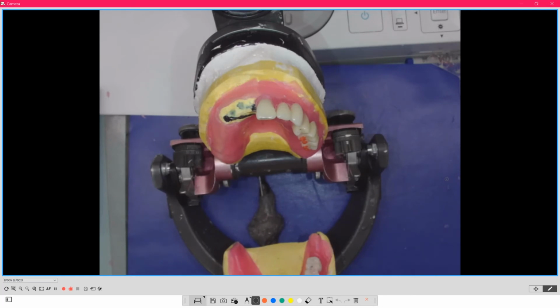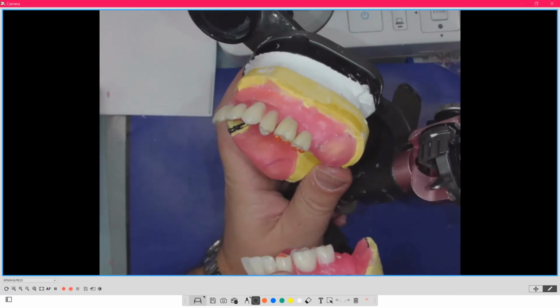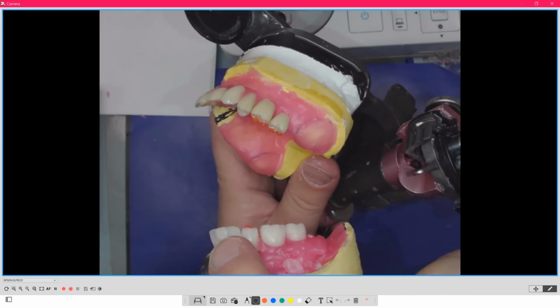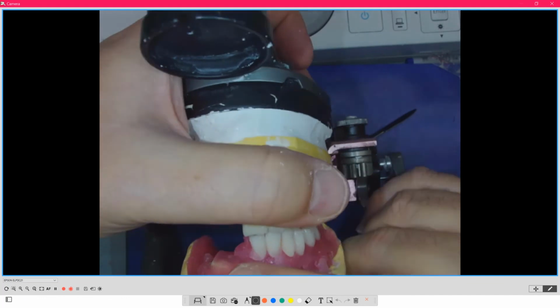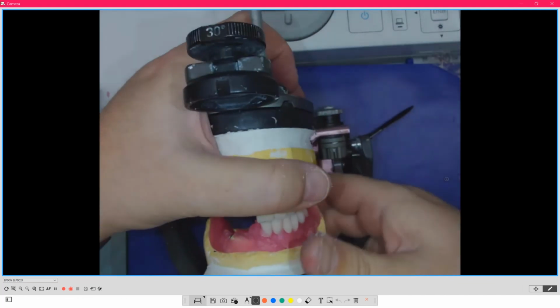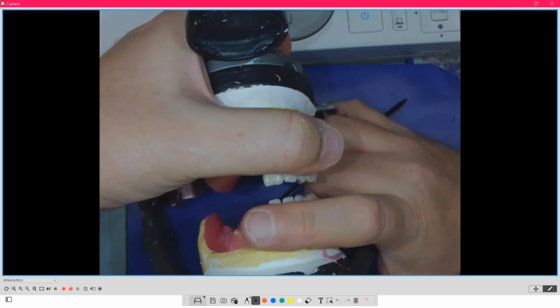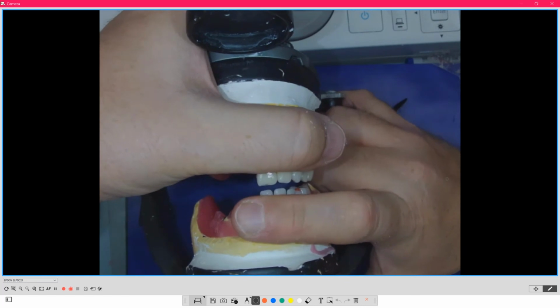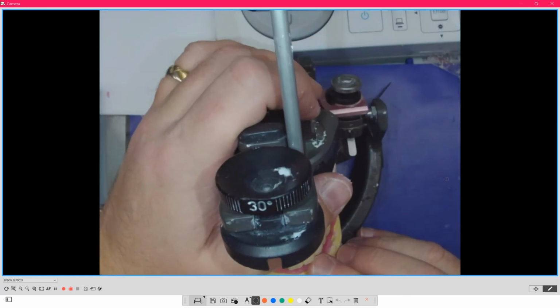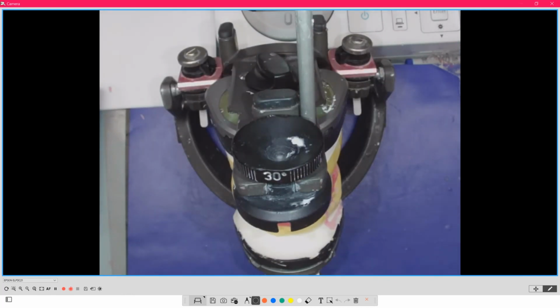And I took the corner off. So I overdid it a little bit just so that you can see it, but you can see now how I took that edge off. And now I'm going to come in there with lips. And what do you see? See, it looks a little bit less flat. So these are little things that you can do to identify and show yourself and modify things.